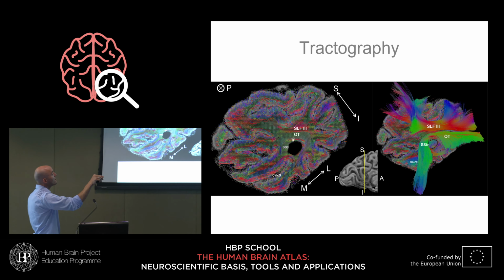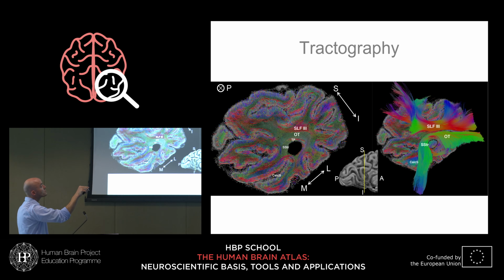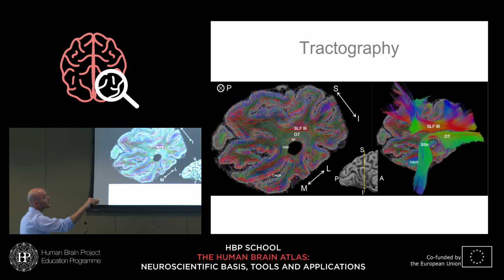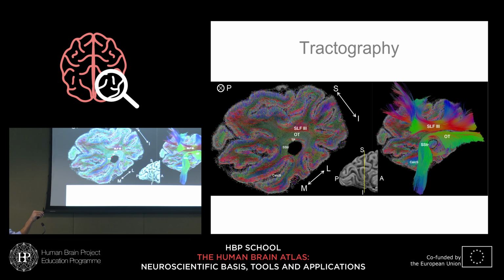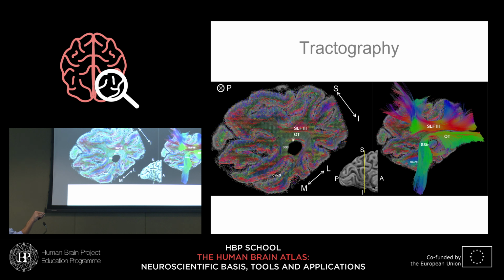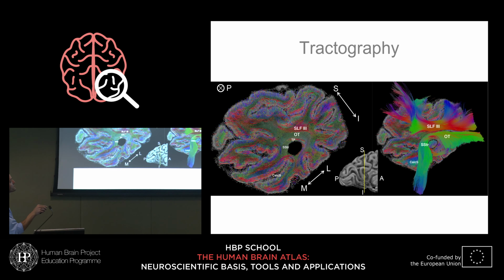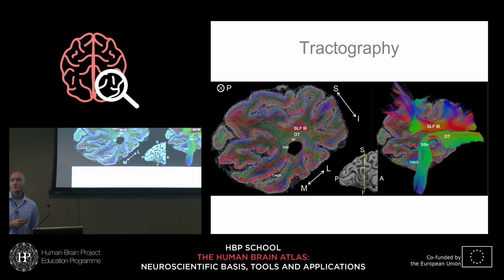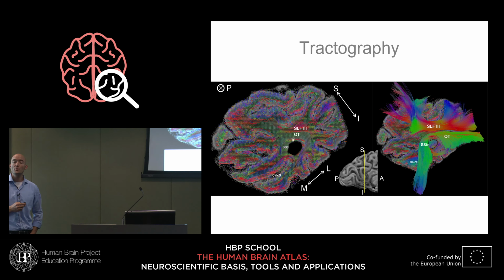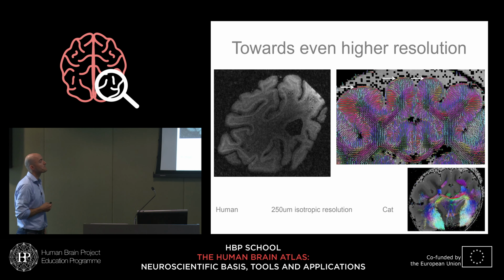Like here is one arm of the superior longitudinal fasciculus that connects more superior parts of occipital and parietal cortex. And there's also the sagittal stratum, which travels at a different part around the lateral ventricle. And in fact, if you look at the direction-encoded DTI fit, the diffusion model fit to white matter, you can very nicely distinguish the superior longitudinal fasciculus, the optic tract, the tapetum, the sagittal stratum, and with tractography reconstruct how those tracts are going to connect early visual areas. And that's a matter of ongoing analysis right now that we have this data.